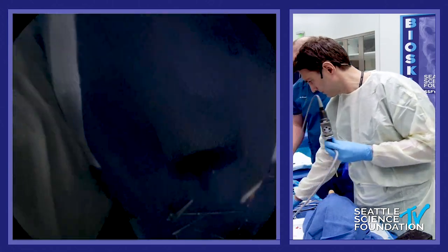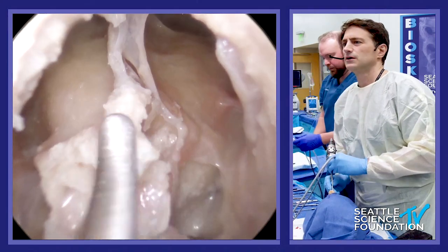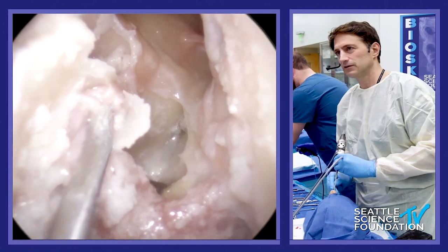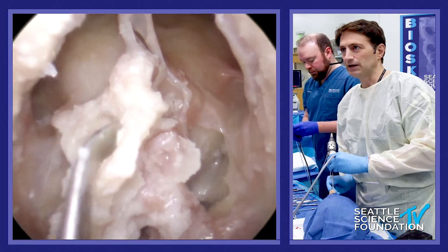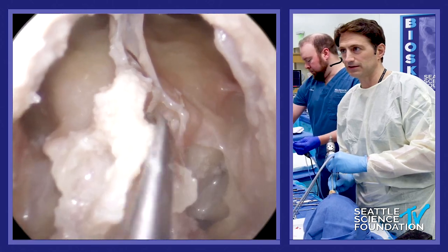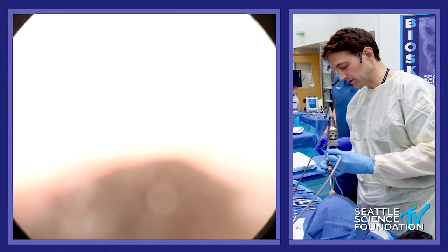So what we have left — let's put that drill back on one more time. I like to take this spike down. Here's the first olfactory fila on this side, and first olfactory fila on this side. You can take down this T — above this area you can actually take it. As long as you're above where the cribriform juts out, you can take this whole thing back to the posterior table.